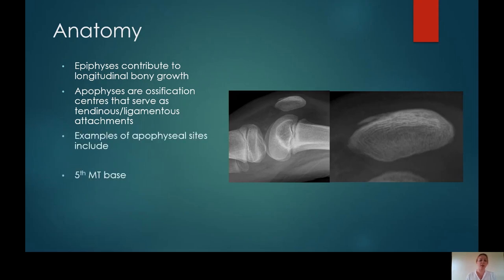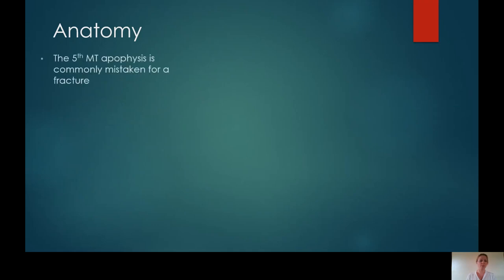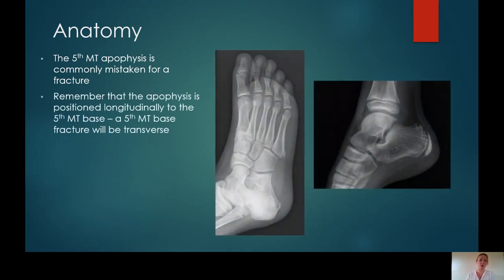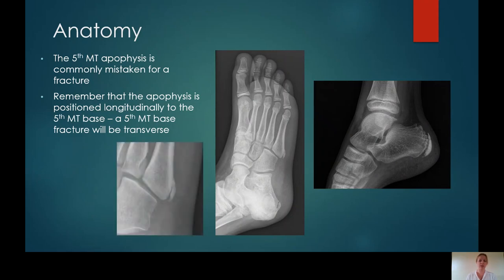You will see apophyses at the fifth metatarsal base, at the calcaneum and also the patella, although that list is not exhaustive. The fifth metatarsal apophysis is commonly mistaken for a fracture. Do remember that the apophysis at the fifth metatarsal base is always positioned longitudinally, whereas a fracture will be transverse. This is an example of a normal fifth metatarsal apophysis, and also a normal calcaneal apophysis.